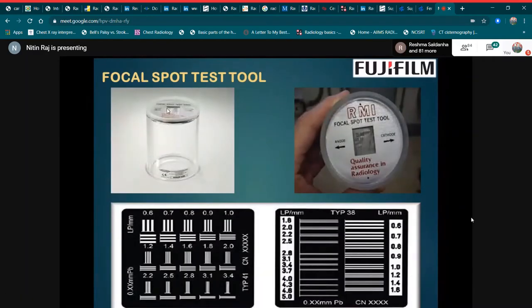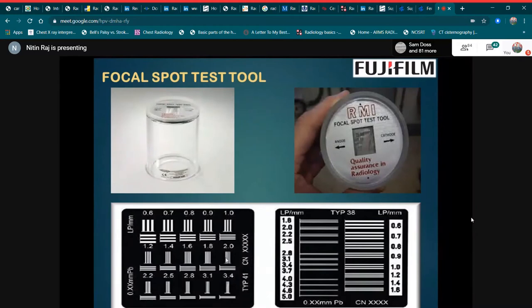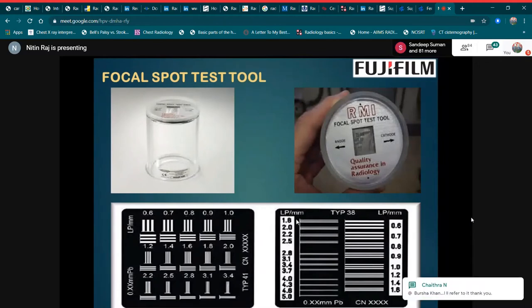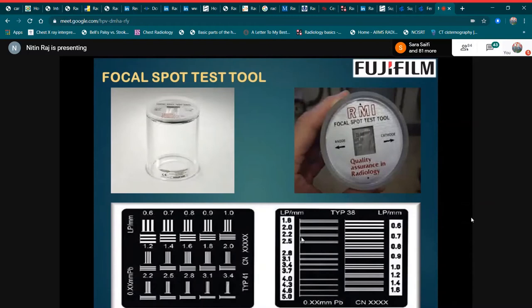This is the tool used for measuring focal spot size. In the image, we can see the lines clearly resolved in the range of 1.8 to 2.0, and also clearly visible in the range of 1.8 to 2.2, indicating better image resolution in those areas.